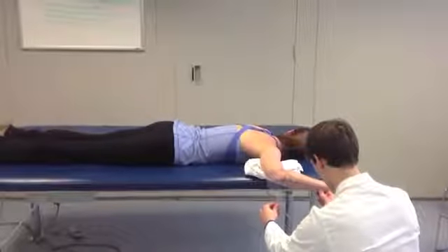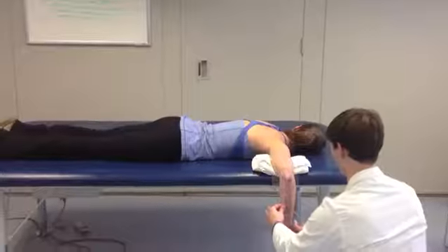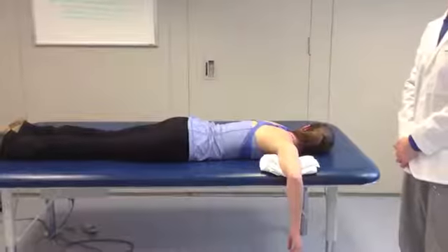You want to document accordingly, and expected outcomes, or what is normal for this joint. Your shoulder range of motion should be 90 degrees, and glenohumeral range of motion should be 90 degrees as well.